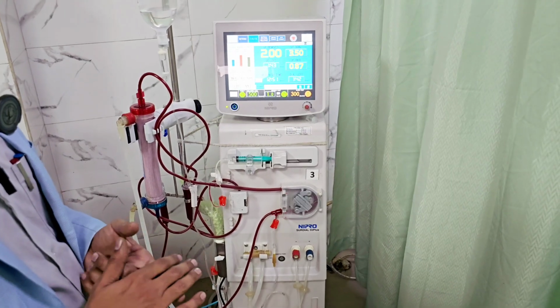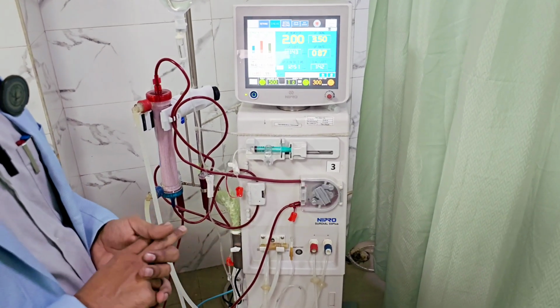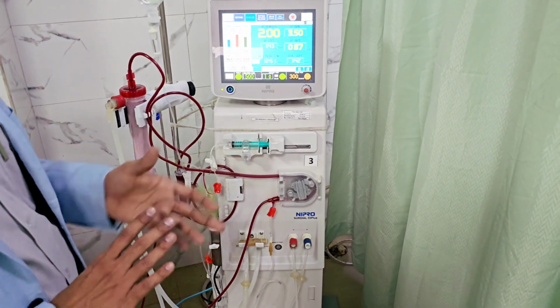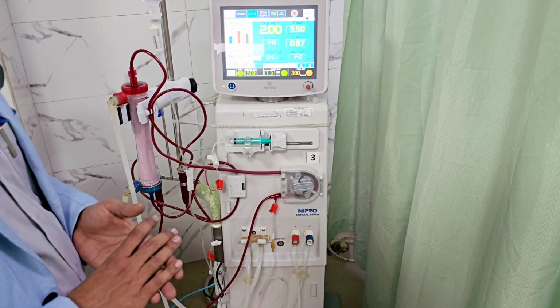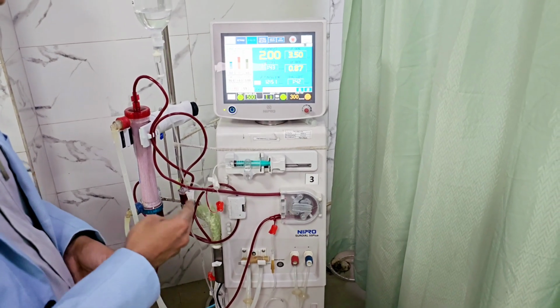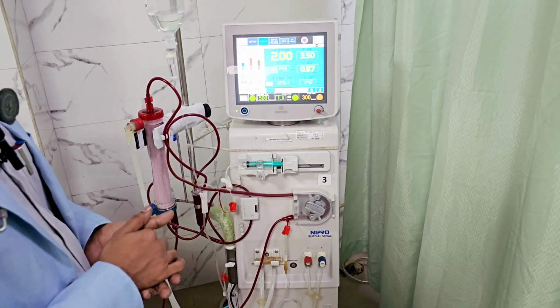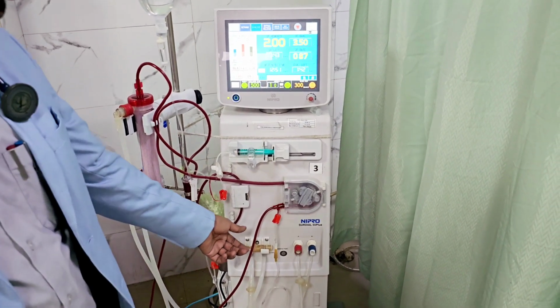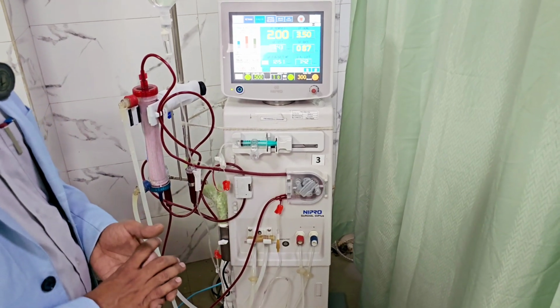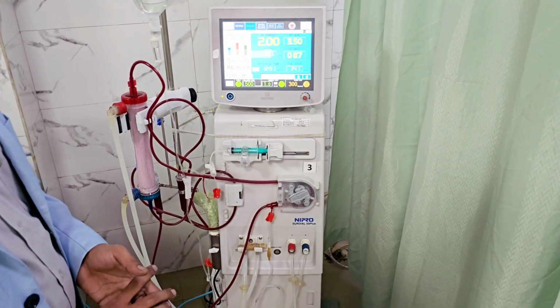Two important parameters at the dialysis technology level you have to remember: one is the interval flushing, another one is the blood flow. And today you have seen how this kind of dilution in the post-pump circuit can be done with occluding the tube and without occluding. Without occluding, the net effect will be somewhat less.